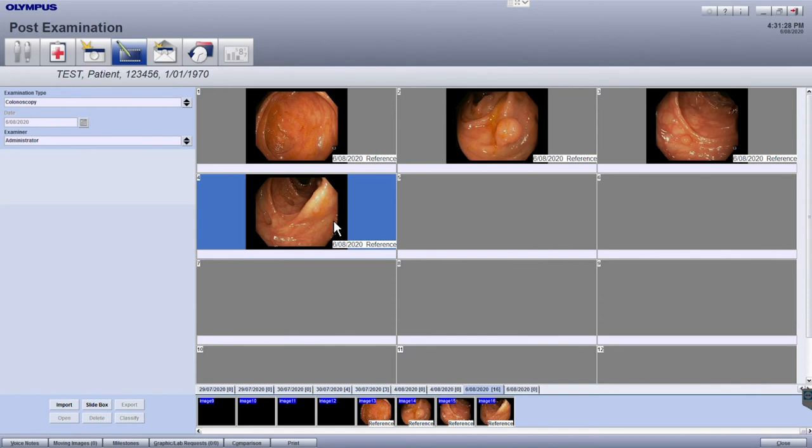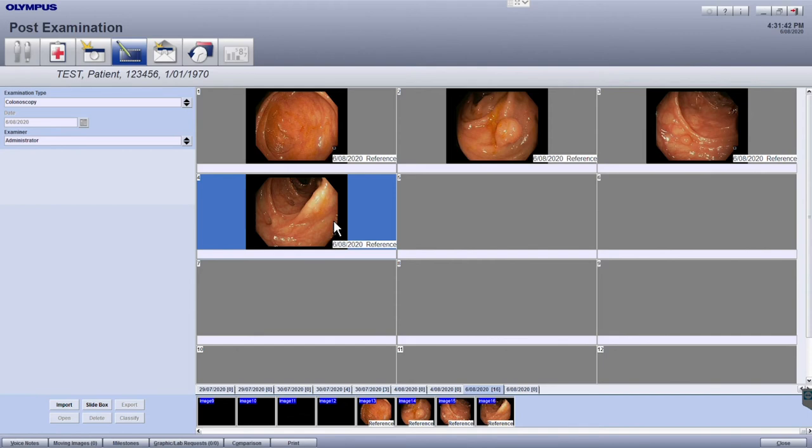For a default one-page report, four images can be displayed, but if you would like to include more images, you will have the option to select a multi-page report template, or request additional customizations to these report templates via our support team. We'll cover the reporting in more detail in the video about how to create and print a report.